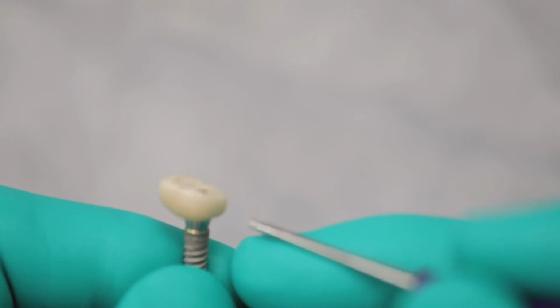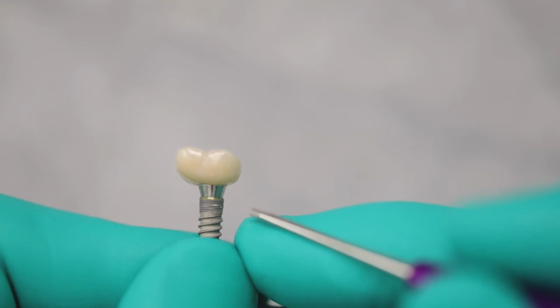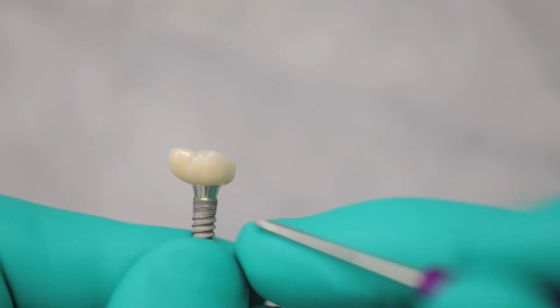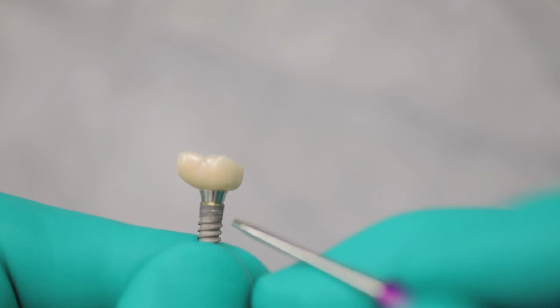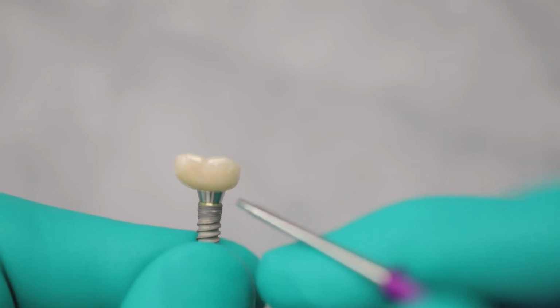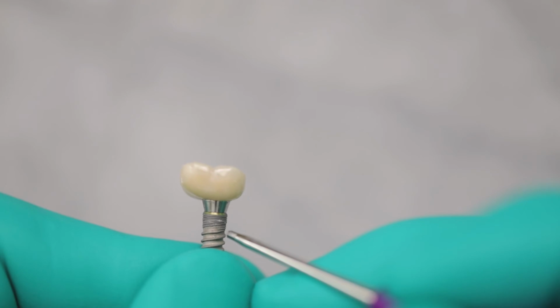Now, we talk about implant failures, and when we do that, they're multifactorial. As you guys know, implant failures are oftentimes multifactorial. One of the problems that we have is that a lot of the solutions that we pick are driven anatomically. So for instance, this implant is a rather small implant for this size crown, okay? So you say, why? Well, one of 2 reasons.